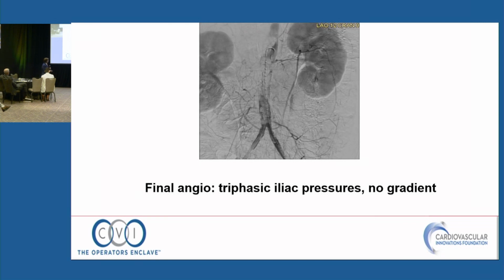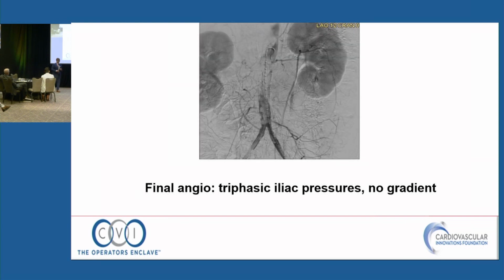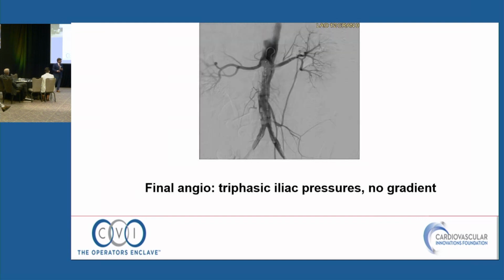Now I'll just stop and we can finish here. Let me ask, to anybody in the room, all right, I've got this. We now have triphasic signals and no pressure gradient, okay? Who would stent it and what kind of stent?